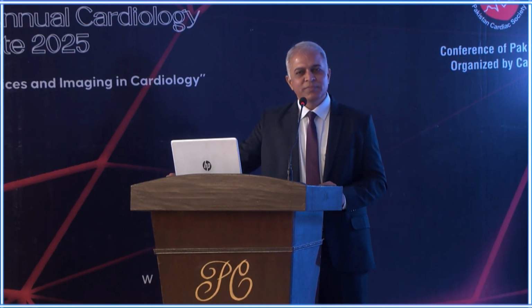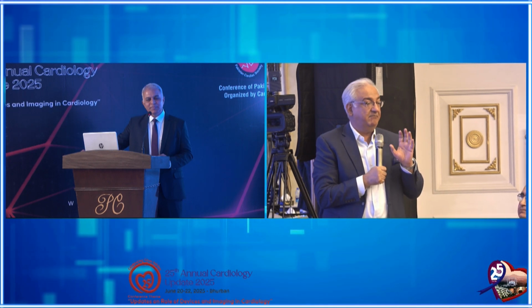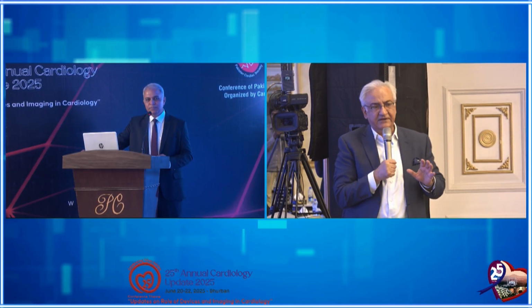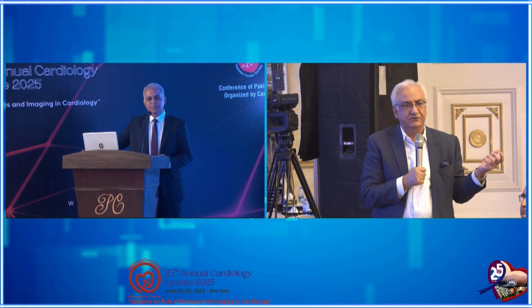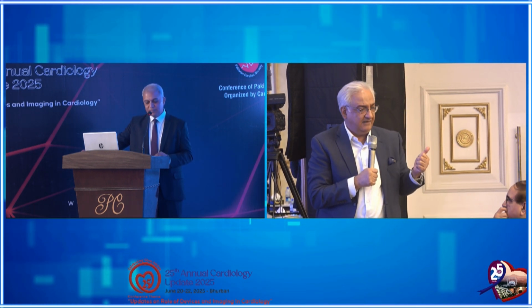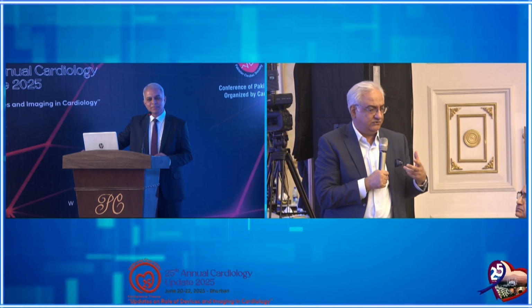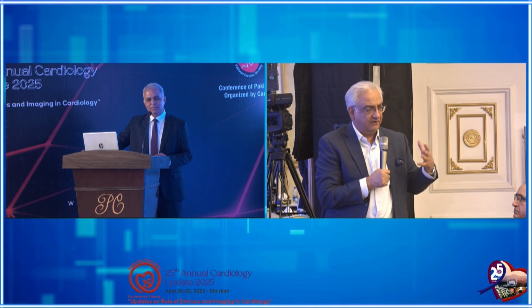So sorry for this. Another comment. We all have very state-of-the-art stents which give us excellent results. If I tell you there's a stent which will give you 28% better outcome, will you take it or not? How much extra money will you pay for it? So if you do an IVUS guided PCI, you're going to get a 28% better outcome. Because then you don't have to worry about the size. If it's well apposed, don't overstretch it. So that's the big difference. I think if you're going to do a left main and a bifurcation, it would be a real big advantage to make sure that you get a good apposition and a good long-term outcome.